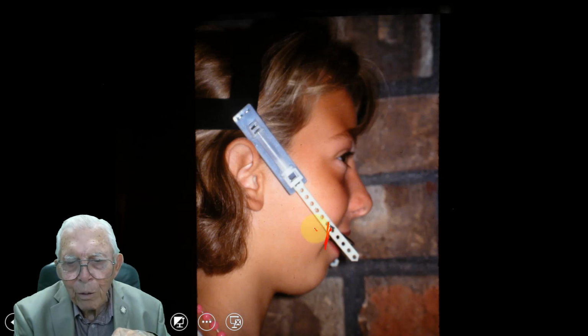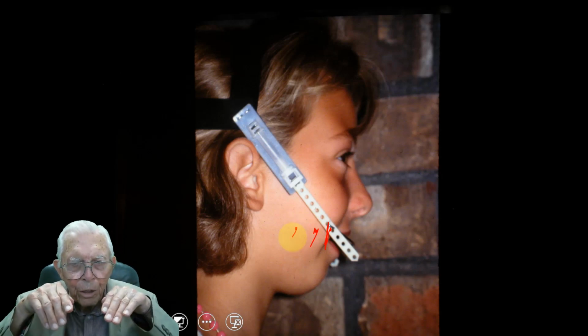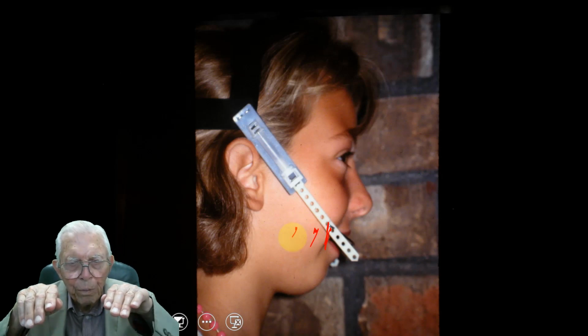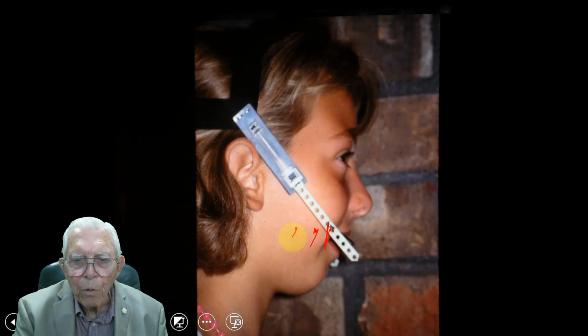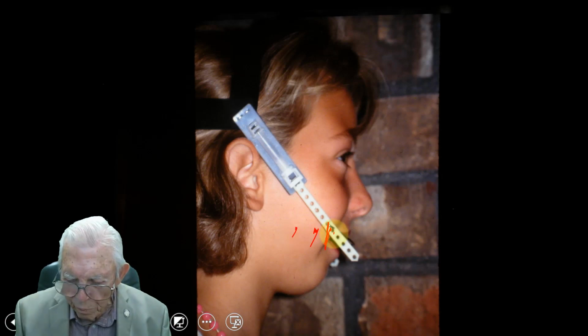teeth up. And you cut that bar here, and if you cut the bar about halfway over, it'll do a different thing. You go back to the back, it'll pick the teeth up this way, or it'll pick them up this way, or it'll pick it up from the anterior where you connect this bar.